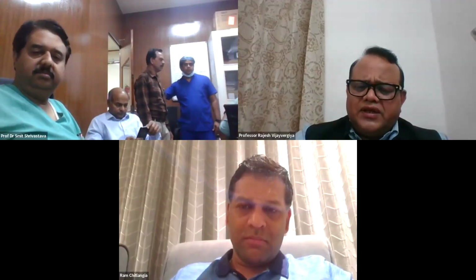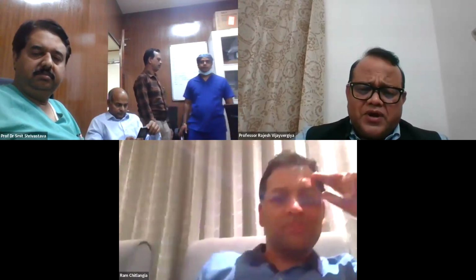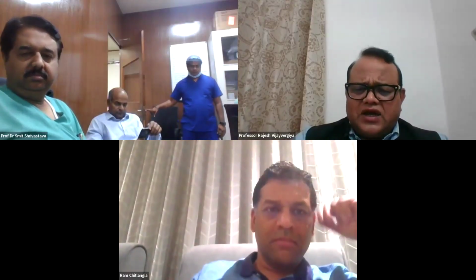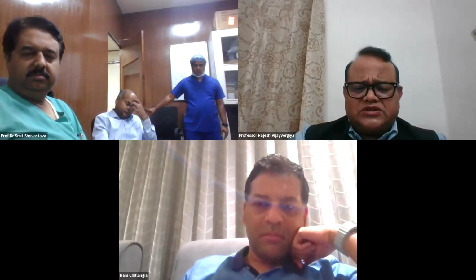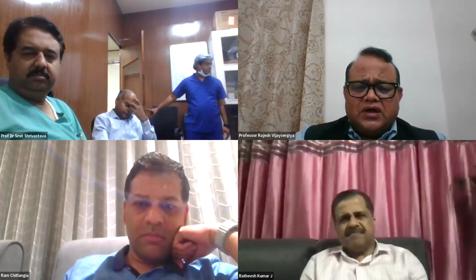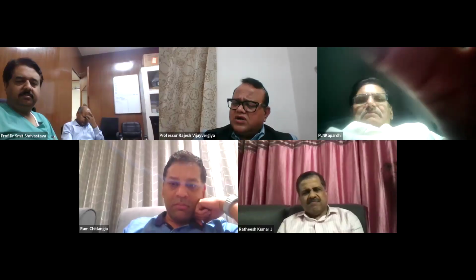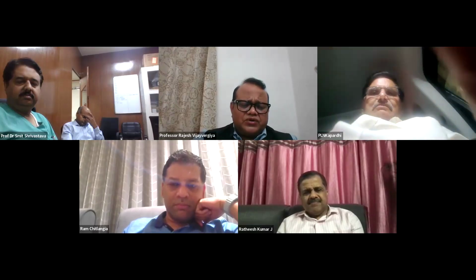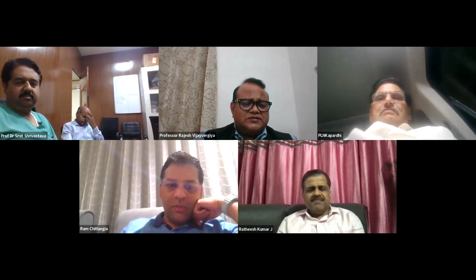No, the main important thing regarding eccentricity: I would say the MLA is more important compared to eccentricity. This is a concern when you are dealing with a calcified lesion. Otherwise, whether it's oval or spherical, the MLA is what matters, as I have mentioned: 8, 10, and 12 are the minimal luminal areas. So instead of going for oval or spherical, it's the MLA which is important to look for during imaging for left main bifurcation disease.